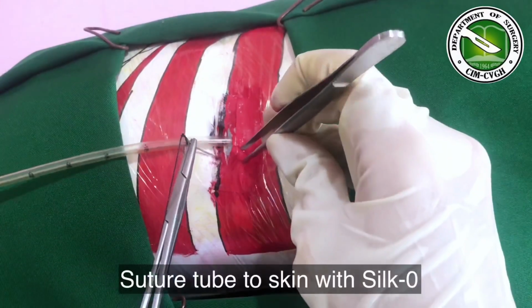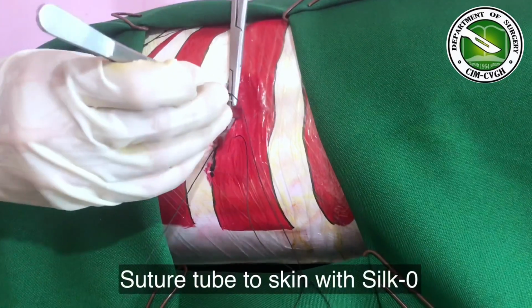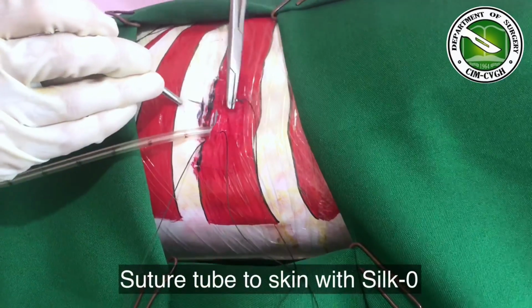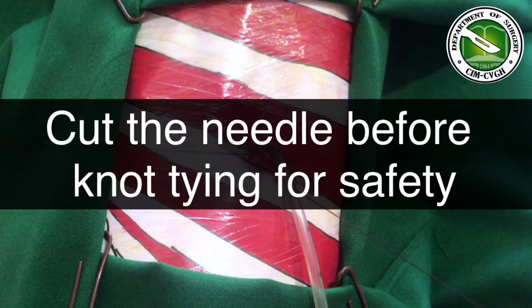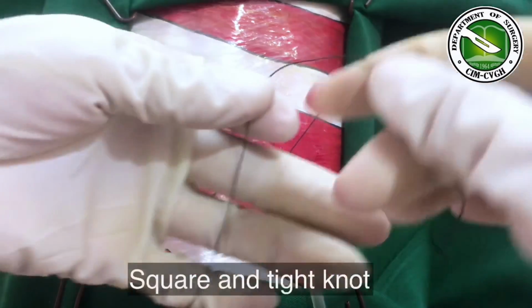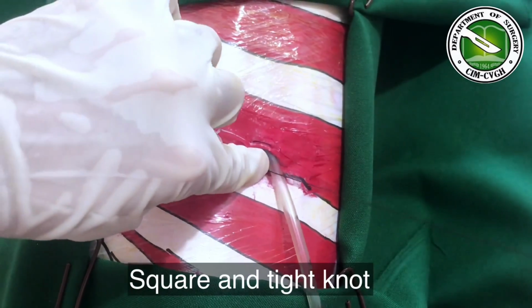Suture the tube to the skin with silk O using a horizontal mattress technique. Cut the needle before knot tying for safety. Tie the suture in place tight to the skin by doing a square knot.